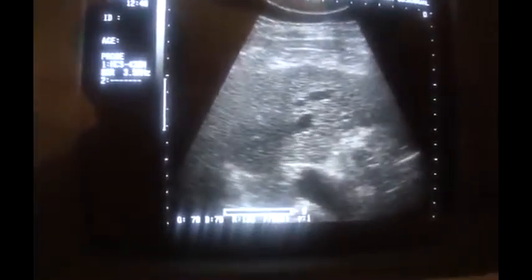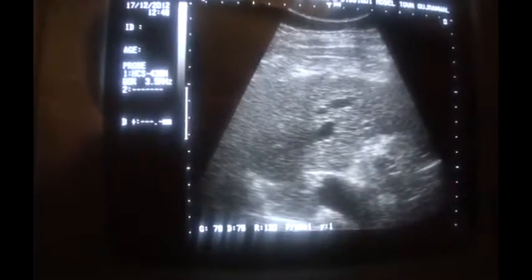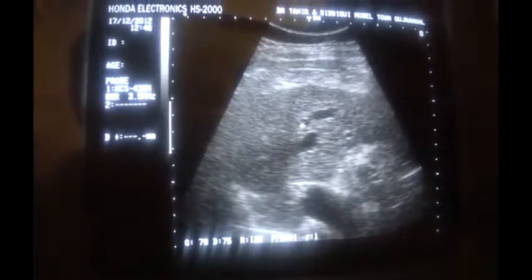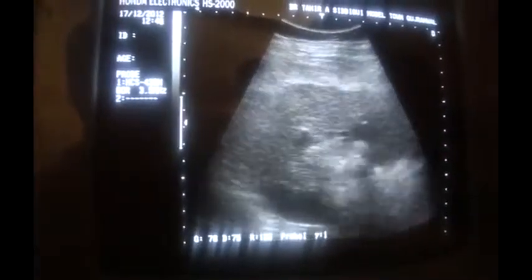This is the liver parenchyma in which you are seeing that the outer surface of the liver is irregular. There is coarseness and the vessel margins are blurred. This is the right lobe of the liver.